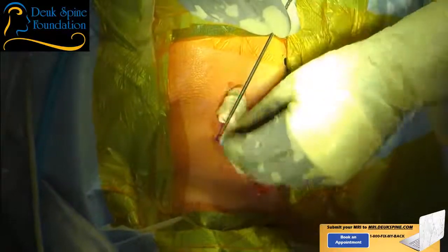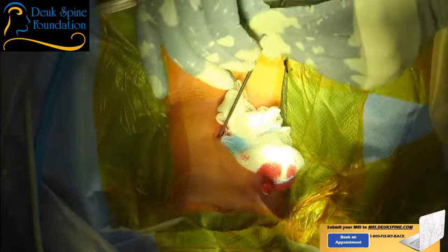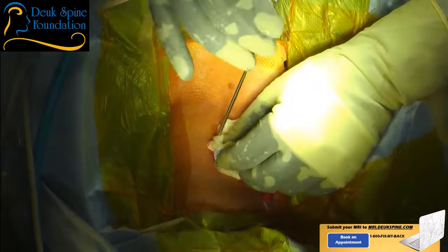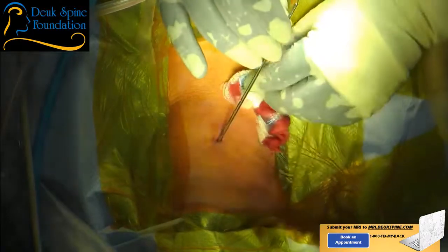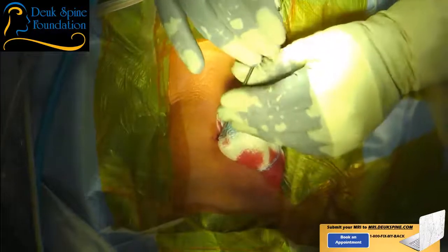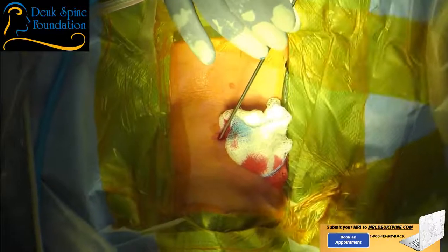So to take the herniations and repair them, shot, we're going to go through the front of the spine. There's 2 ways to get to the cervical spine areas that have herniations. One is through the back, the other is through the front. The front is much better than the back because the herniations are always in the front. Shot. So the best approach is just as we're doing through the front, called anterior. Now, most surgeons do a much bigger incision. Shot.